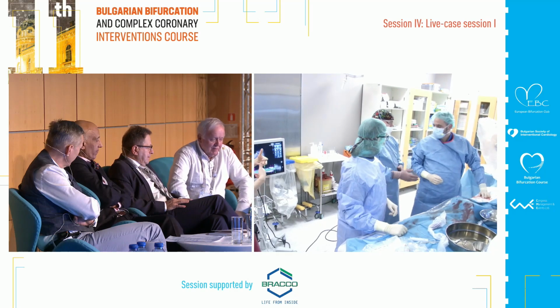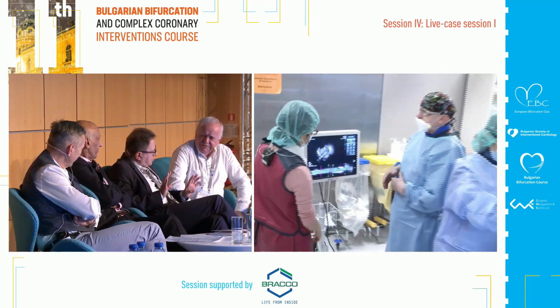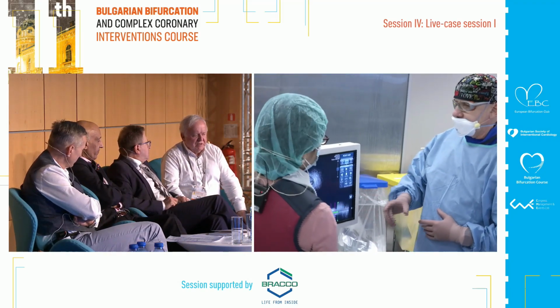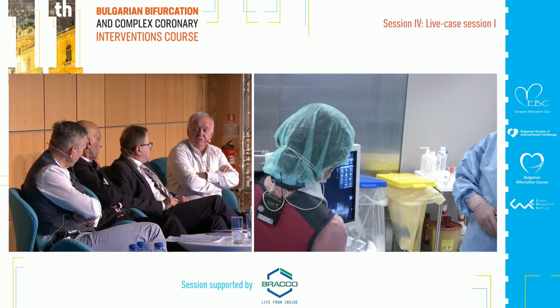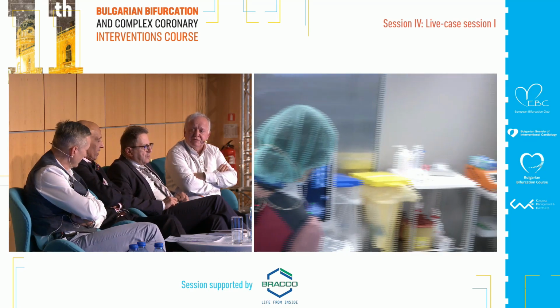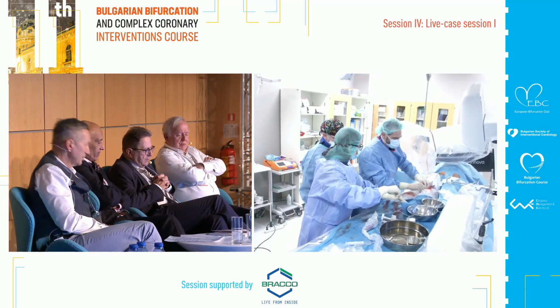No, I think you can overlap proximal to the diagonal. Do you have enough space? Up to 4.5? Yes, there is enough space. If you take a balloon or a stent which is 3.0, you can go up to 4 millimeters. So we suggest to pre-dilate with 3.0 and reanalyze the left main size with IVUS.